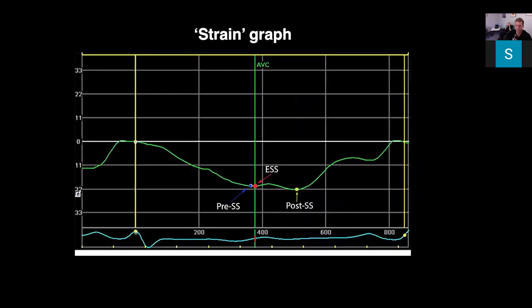Okay, the other thing I find fascinating about speckle tracking, and this is where maybe the love-hate relationship that I have with speckle tracking comes from, is that you can get a lot of information from it. And this is good and this is bad, okay? So let's talk about the information I'm talking about.